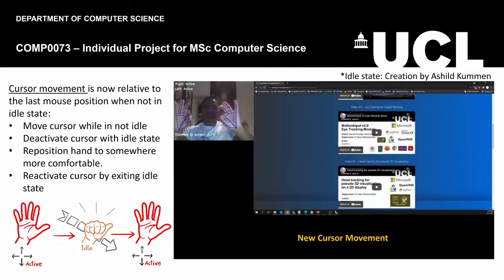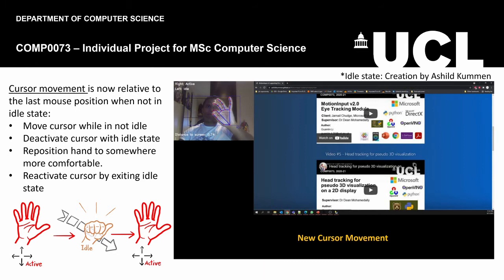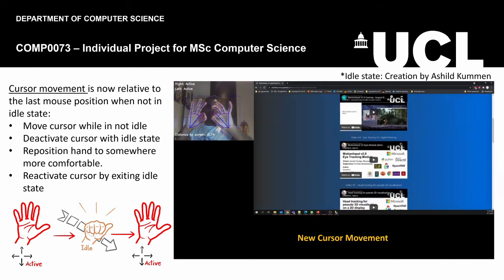The cursor moves relative to its last position before being disabled, unlike before where it would just jump to a new position. The advantages of this are being able to use multiple screens regardless of the layout, and also being able to click elements nearer to the screen corners whilst your hand is still in an optimal position right in front of your camera. The addition of a contact radius as well, being added to touches, also makes pressing small UI elements a little bit more forgiving. In the video, you could also see me use the Windows Touch API in the browser, which is quite easy because it makes it a little bit easier to scroll and zoom in and out.